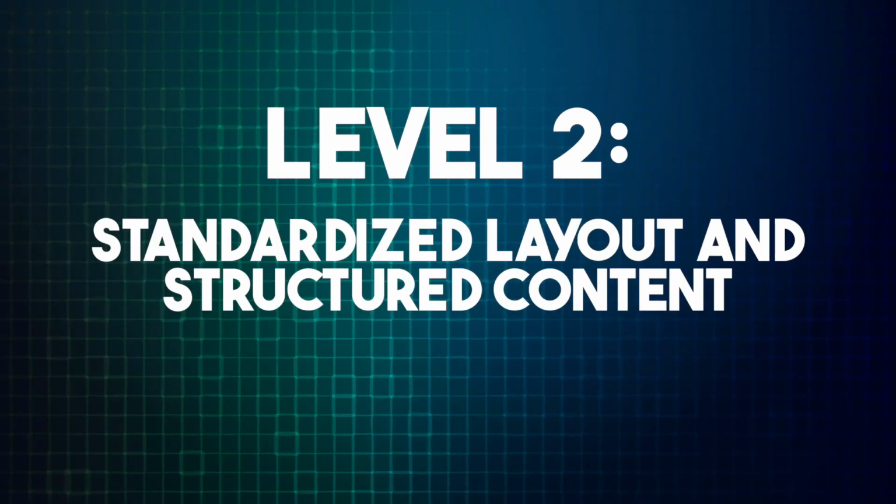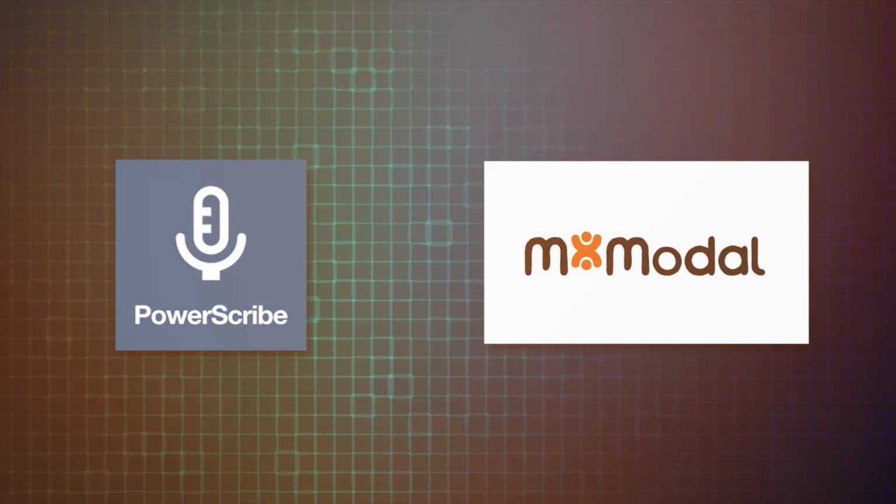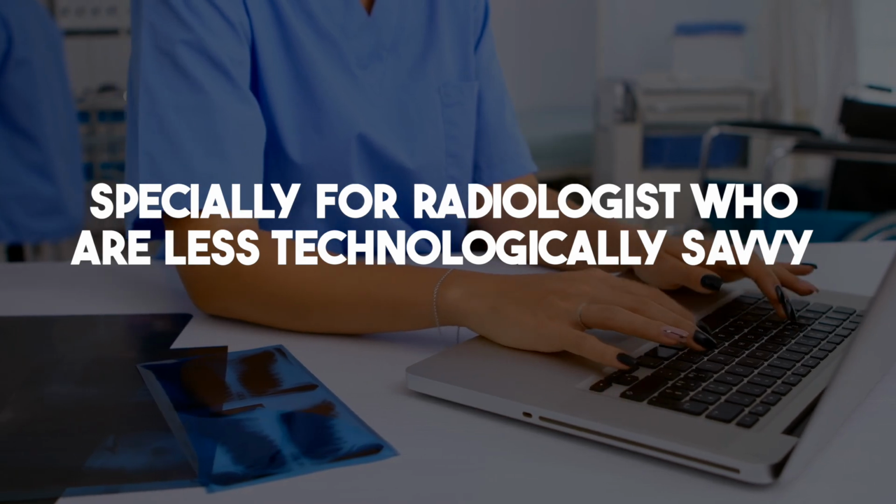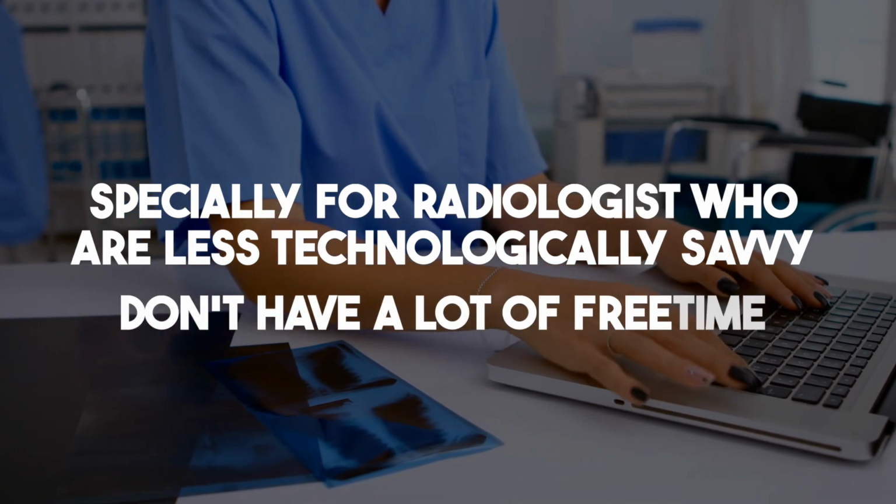Level 2 builds upon that standardized layout by incorporating structured content to help organize clinical information beyond the organ-specific details. Depending on the reporting package you're using, PowerScribe or M-Modal, you'll end up using different drop-down menus or pick lists or some other point-and-click to supplement the speech recognition and to facilitate the insertion of routine structured content. Level 2 implementations are less common because of the IT dependency, especially for radiologists who are less tech savvy and don't have a lot of free available time.